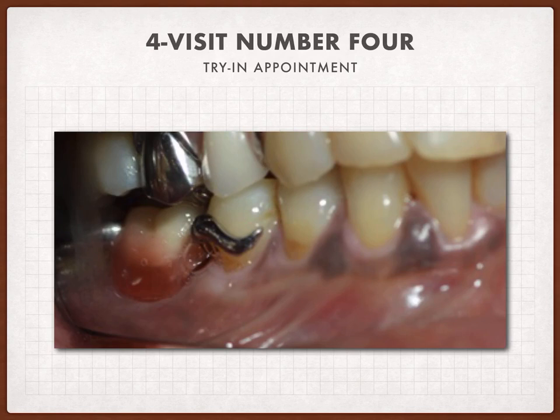Also, the second thing is to check aesthetics and phonetics. Aesthetics is according to your experience, to see if the teeth are beautiful, if the patient is okay with them. We check the high lip line, the low lip line, the shade, the shape, the size and arrangement of teeth.